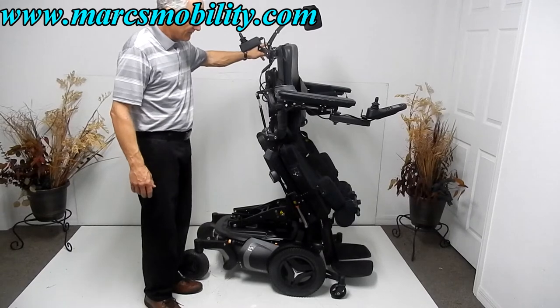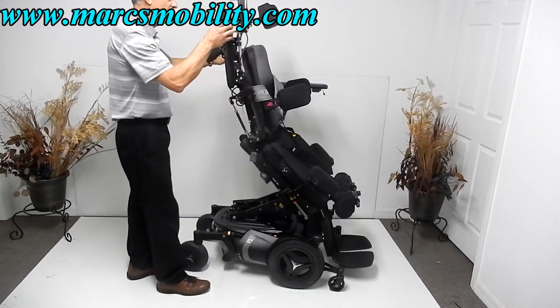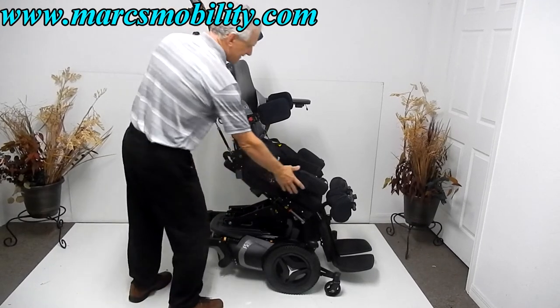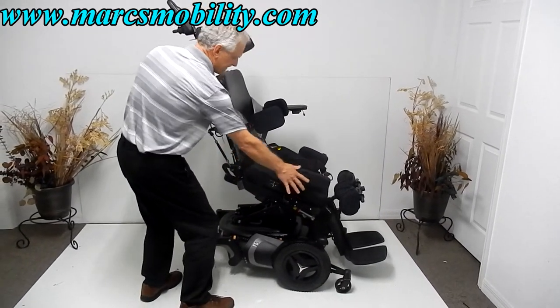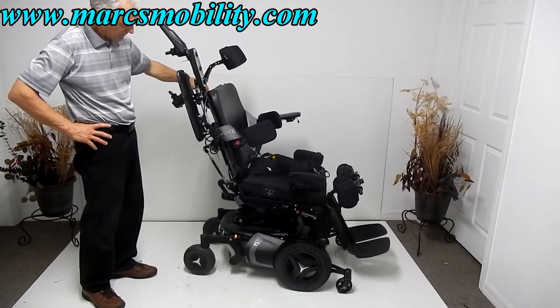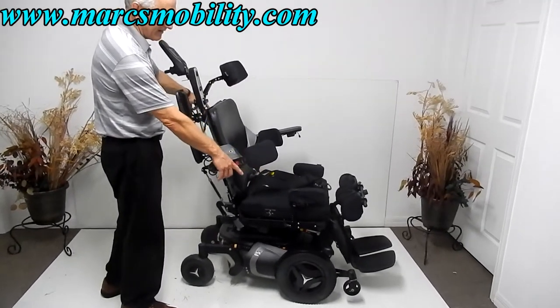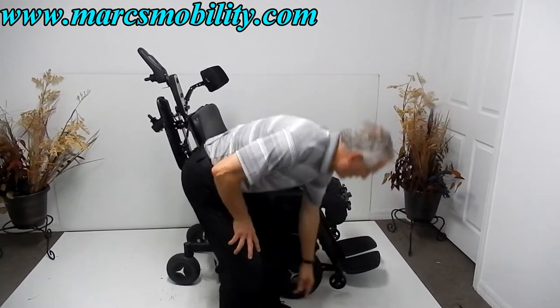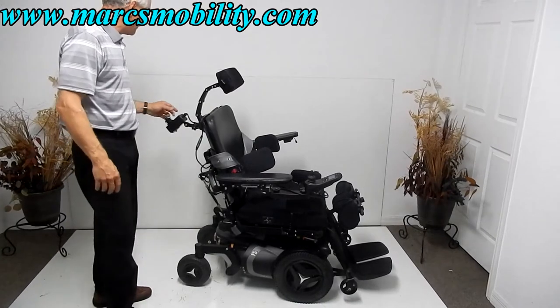I'm bringing the seat back down while I talk more about the arms. The arms can be elevated out of the way for side transfers — sliding board transfers, or transferring from a bed. The side leg rests can also be removed by loosening them so there's nothing obstructing you when you get in. As you can see, the front wheels came off the ground as the seat returned to sitting position — they were touching the ground while the chair was in standing position.